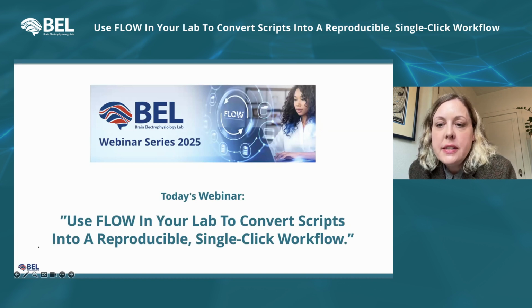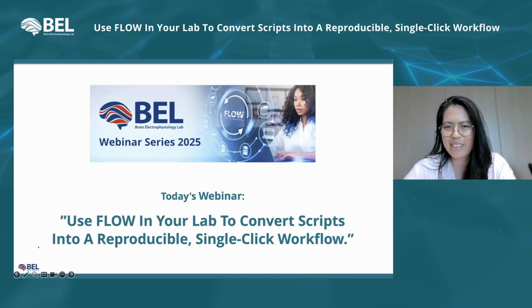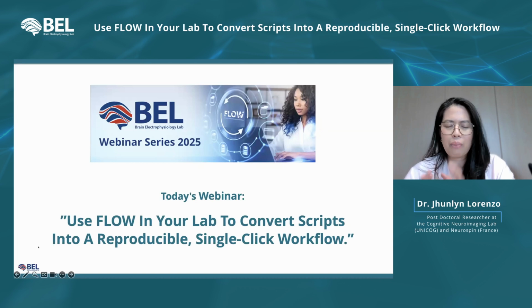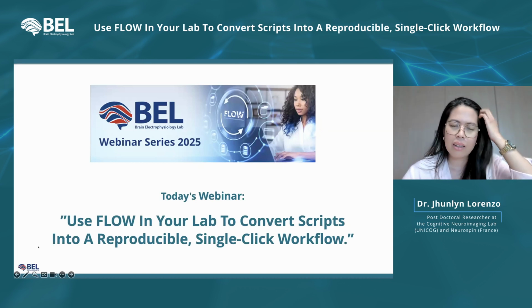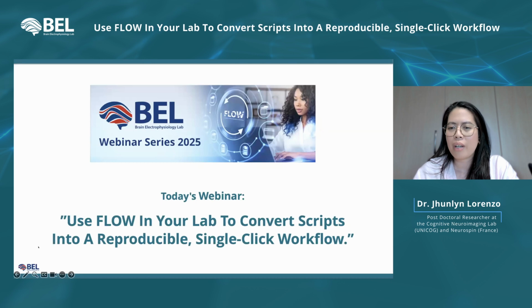Our first question is, Dr. Lorenzo, do the EEG artifacts change systematically between infant recordings and toddler recordings? Are there guidelines for settings for APICE for each group? Well, that's a very good question. Actually, there is quite a big difference between infant and toddler data, especially in the movements. Toddlers tend to move more than infants, so there are more motion artifacts.